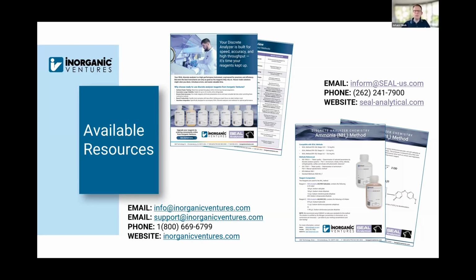That's going to depend on how many samples per run you're doing. You can check the method document and see how much reagent per sample is being used. Multiply that by your samples, calibration standards, and controls. See how many pulls out of that bottle you're doing per run to get an idea of how full you want to fill that reagent for each run. You don't necessarily have to repour after each run, but I generally don't like to leave my reagents sitting on there for more than a day.